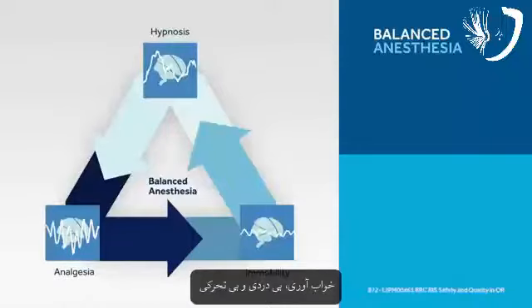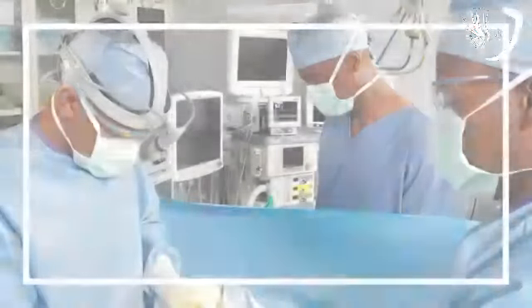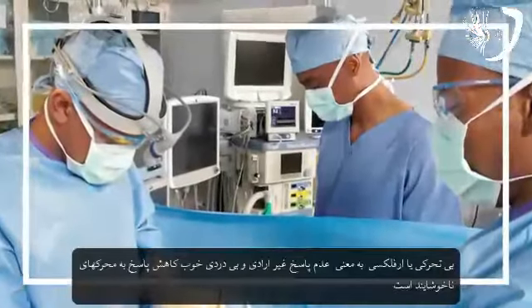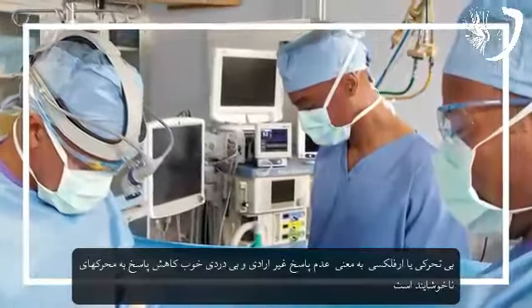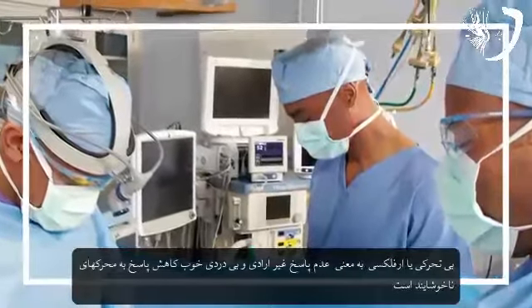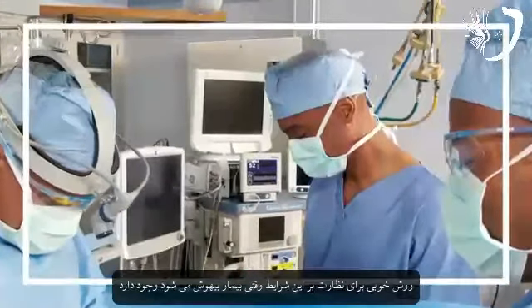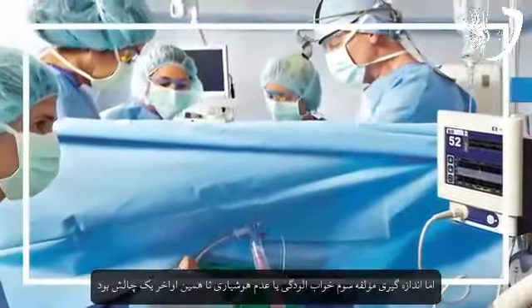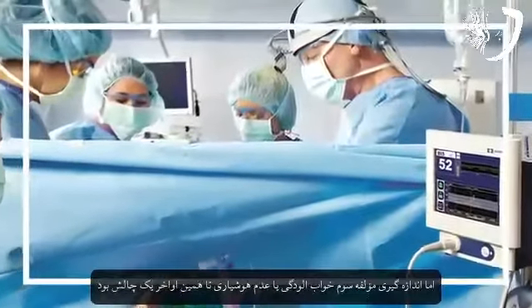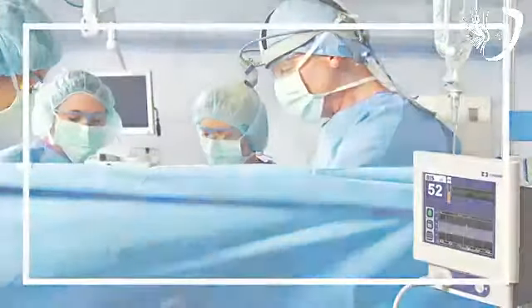But without a means to objectively measure the level of sedation, patients may be oversedated or undersedated. Immobility, or areflexia, is the absence of involuntary movement, while analgesia is a diminished response to unpleasant stimuli. There are well-established methods to monitor these conditions when a patient is anesthetized. However, measuring the third component, hypnosis, or lack of consciousness, has, until recently, posed a challenge.